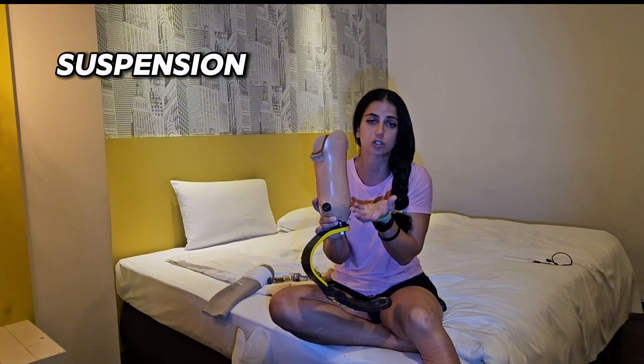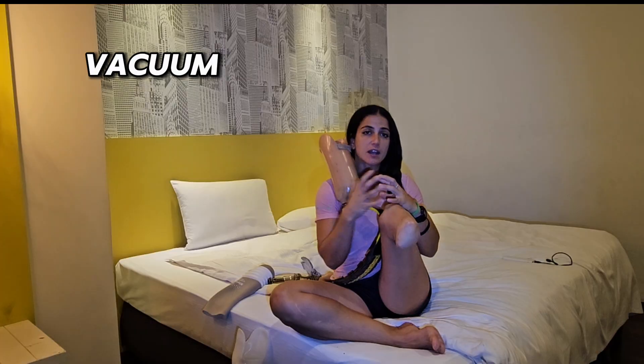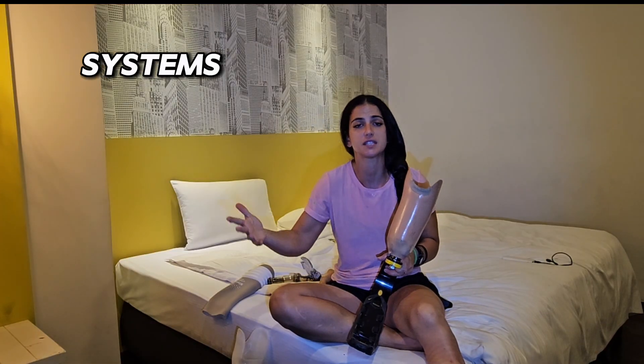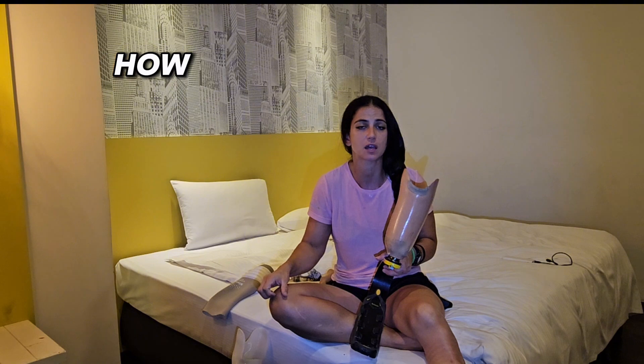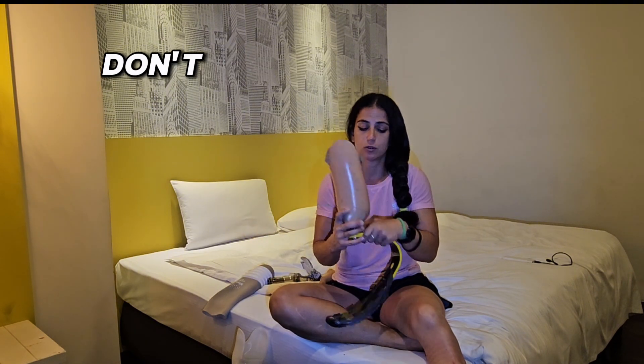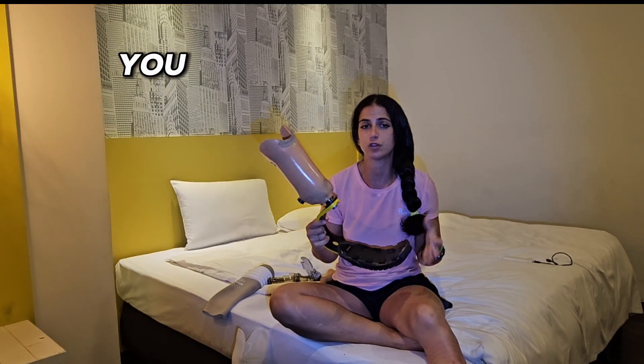I have a vacuum system, so my stump will be held by vacuum inside the socket — I prefer that. But there are different systems depending on what's comfortable for you. Some people don't use valves; some use a suspension sleeve. It's very personal.